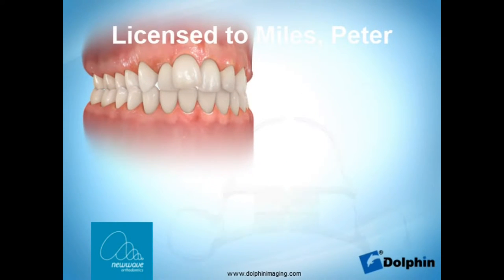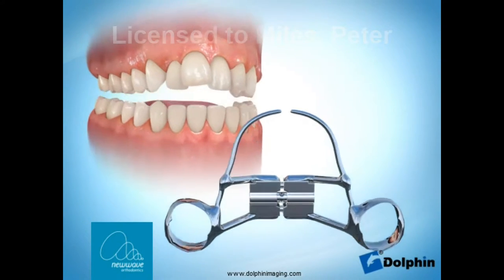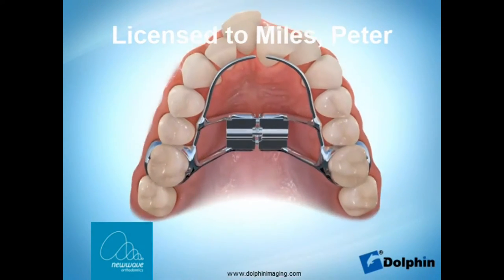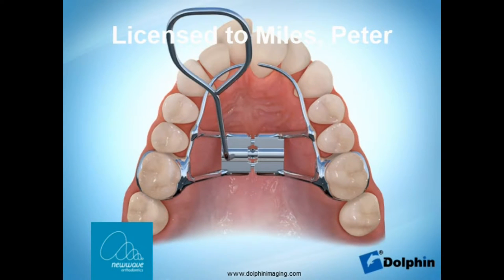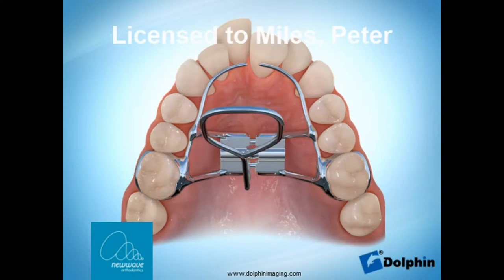With a rapid palatal expander, the expander sits in the roof of your mouth and there's a device in the center that you'll turn on a regular basis with the key we provide you. This is usually turned once per day for roughly a month, but we'll provide you with the date that we want you to stop turning your expander.